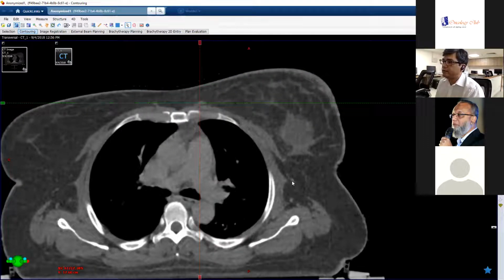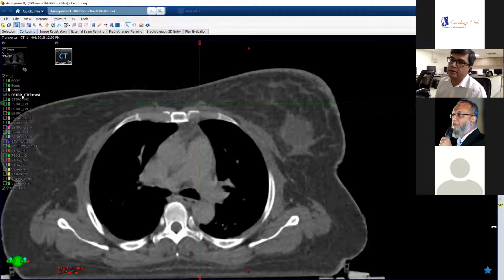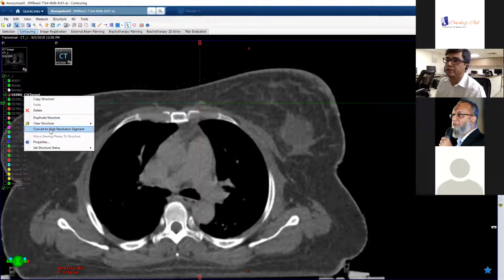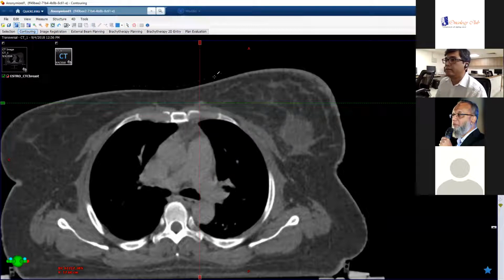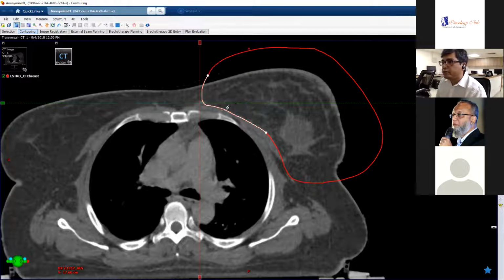I can see this structure here. And my breast CTV is going to be something like this. We'll keep my medial edge here, keep ahead of the pectoralis major muscle here, come back, and cover this like this. I'm going to change this obviously, but just for demonstration purposes, this is what I want to treat.